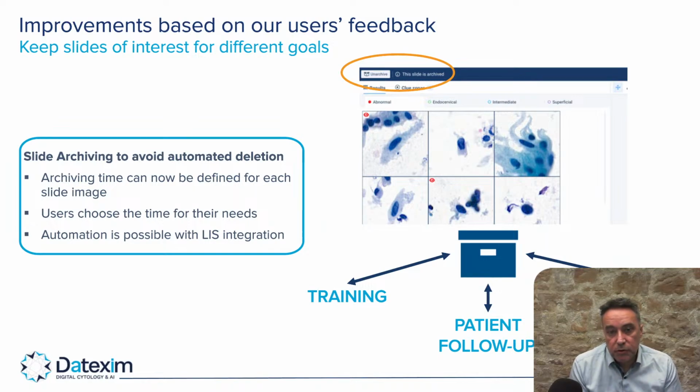So that's a feature that was requested from one of our users, because when they have a positive case, they want to keep the slide for 3 years, and after that delete it. But they also want to keep some slides forever for training purpose, for example. So we added this possibility into this new version.